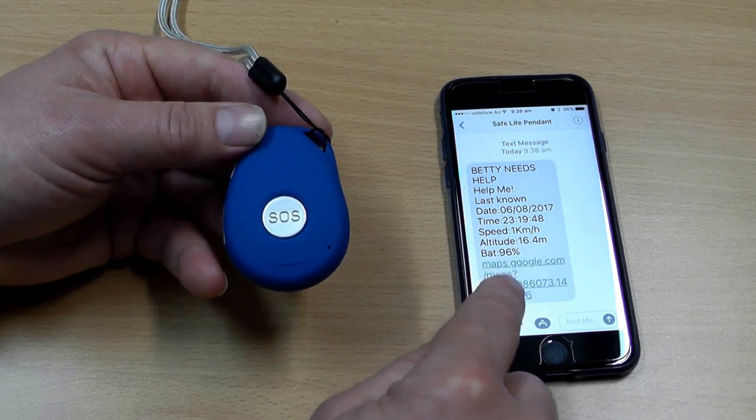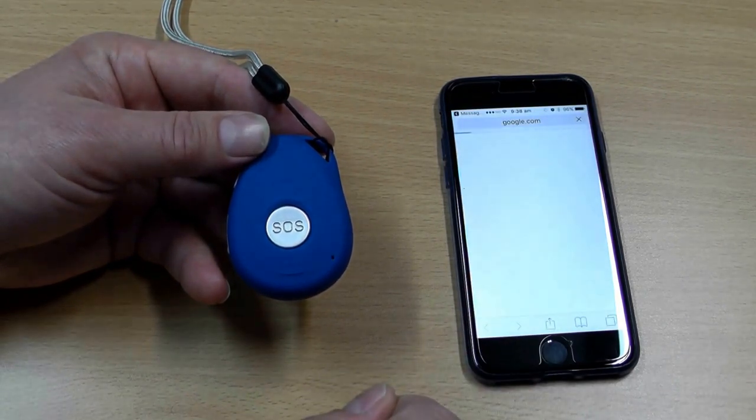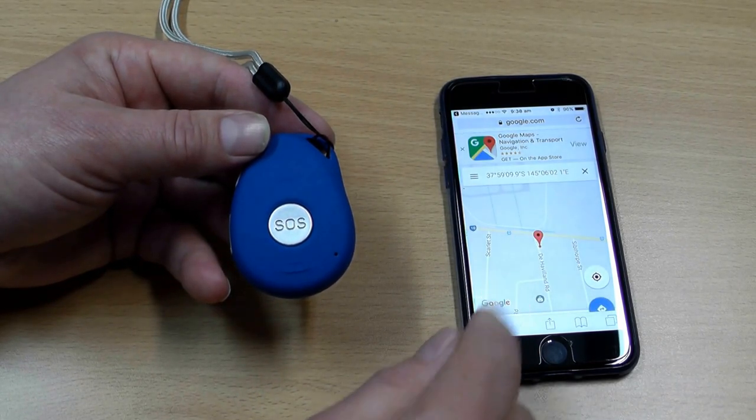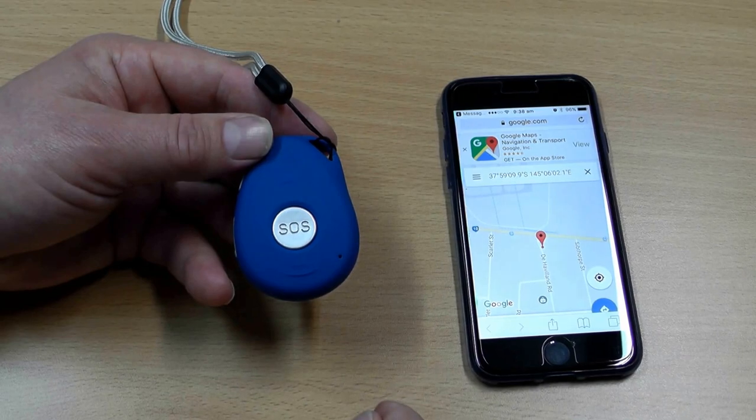This is the Google Maps coordinate, so if I tap that it takes me into Google Maps and shows me on the map the location of the SafeLife Pendant — and that's where we are at this moment.